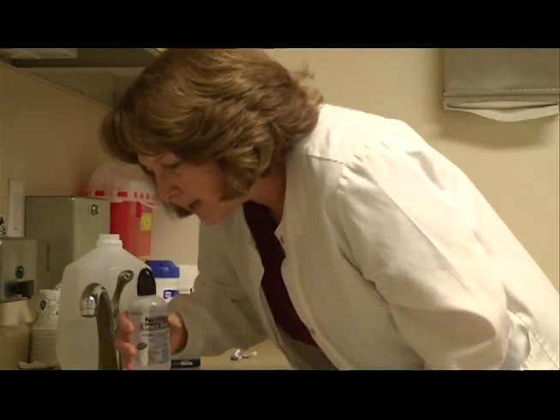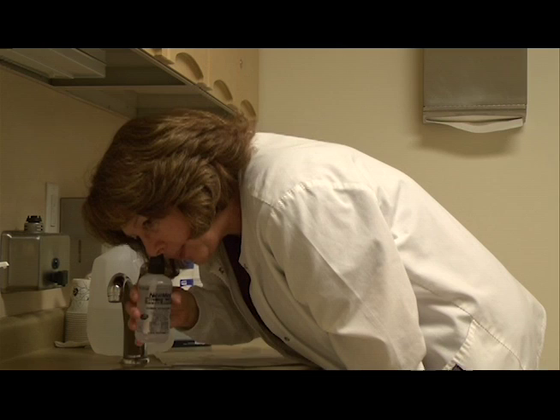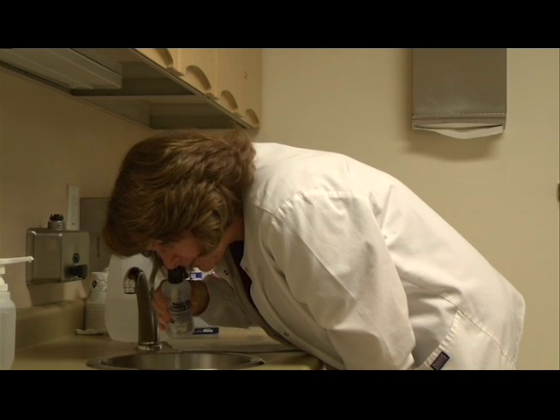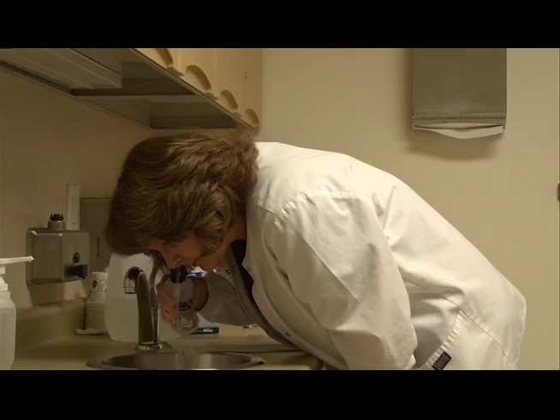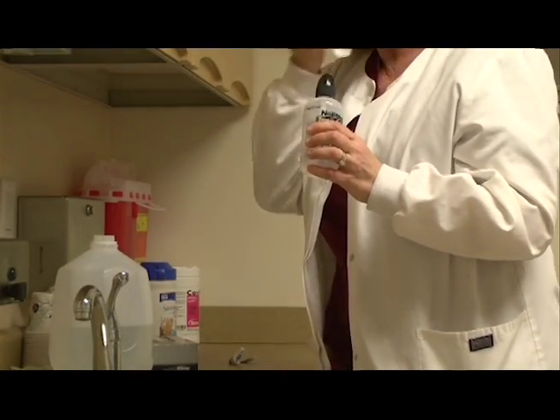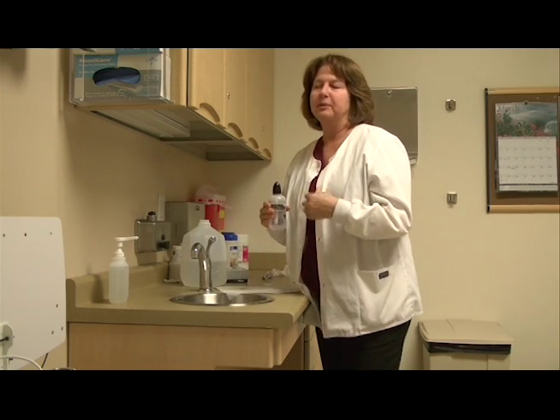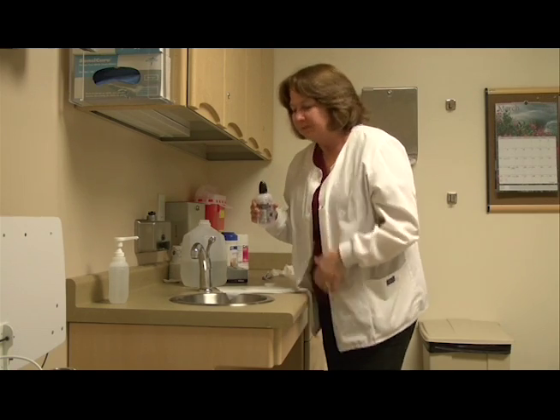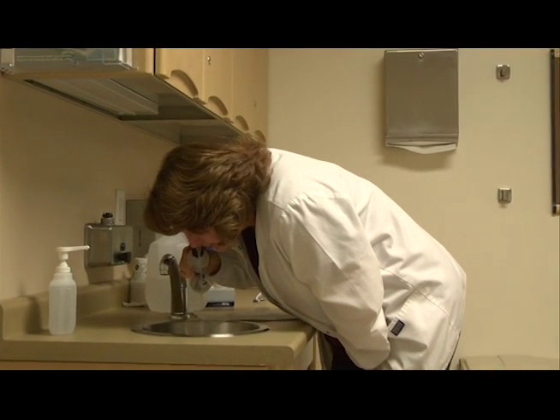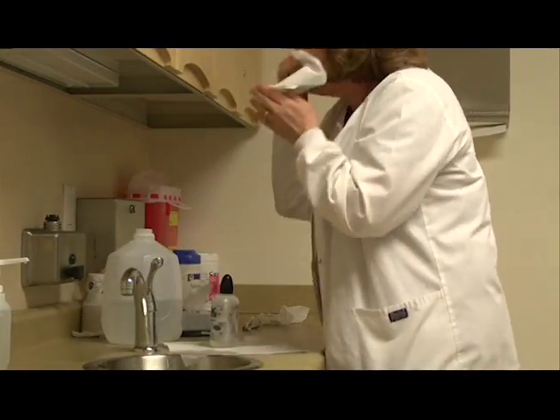Bend over and tilt your head a little bit to the right if you're going to do the right nostril. Put the cap in your nostril and squeeze gently until it comes out the other side of your nose. If that feels a little uncomfortable, you can actually blow out your nose while you're putting the water through — sometimes that's more comfortable. Then you want to blow your nose gently.